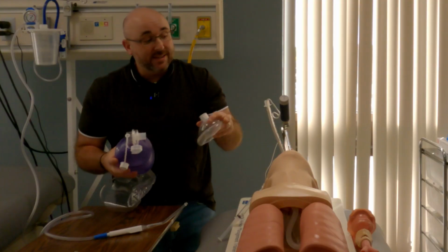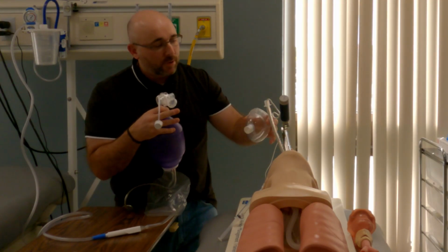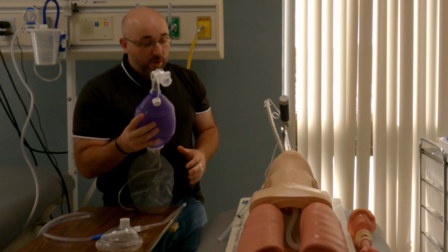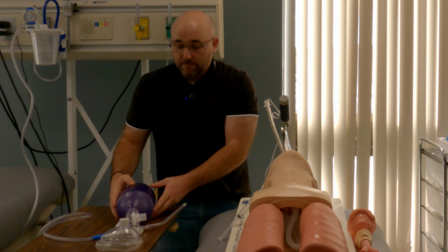As that tube's going in, you can kind of tell by the body language of the person intubating that this might be going in, and you pull this off. Now this should be the next thing in your hand, and you're waiting for the person to be able to attach this.